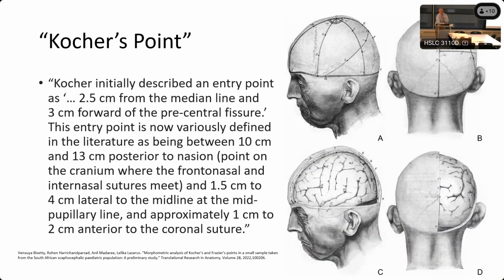So where do we place the EVD? In a situation that doesn't have a lateralizing quality, there are typical points described up here. You could also go with other very safe access points. And if for some reason one of them is not available, there's still another away from the challenge with that side.